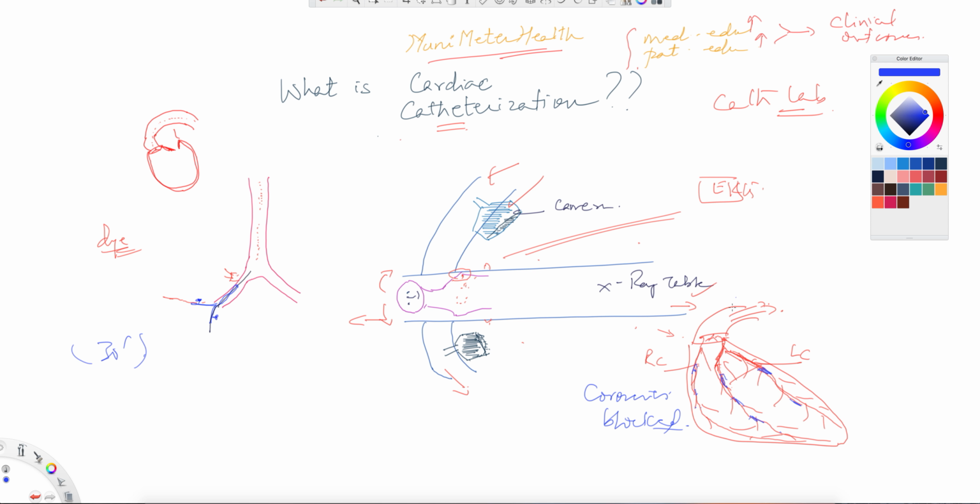We'll show it with a different color here, for instance, and that stent will be placed here right away with a similar catheter, again up the guide wire. This guide wire, which is right here, and the catheter is passed all the way up here like that. This time it's a different catheter, because this catheter has not only a balloon, but also is capable of deploying a stent. So that's when they're doing the stent, after they have inferred where the obstructions are.